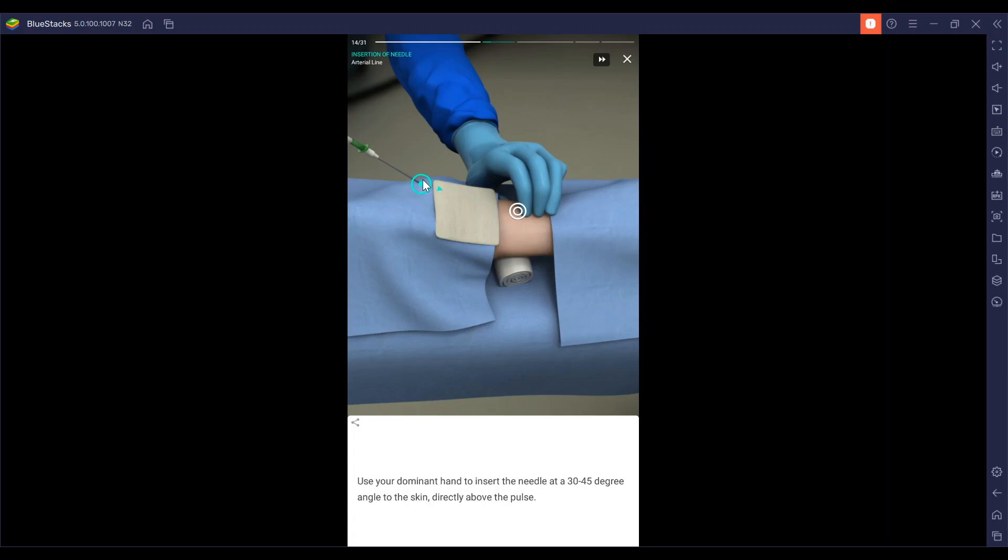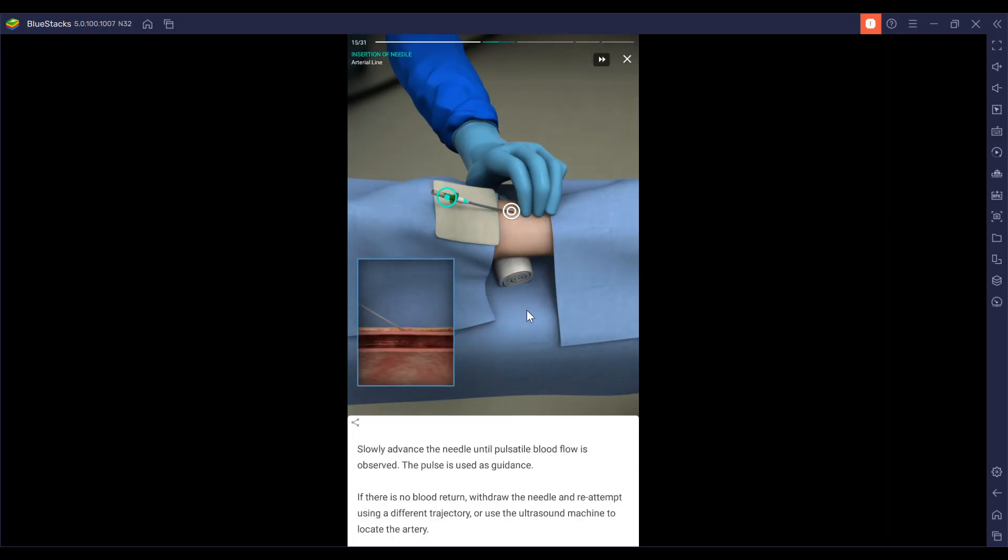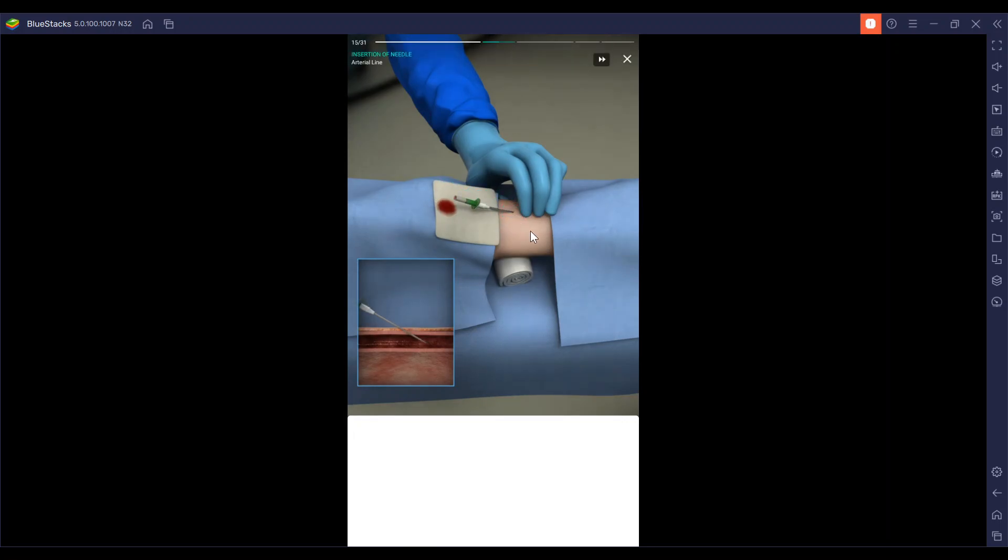You're going to insert the needle at a 30 to 45 degree angle directly above the pulse. Now we're going to slowly advance the needle until pulsatile blood flow is observed and the pulse is used as guidance.